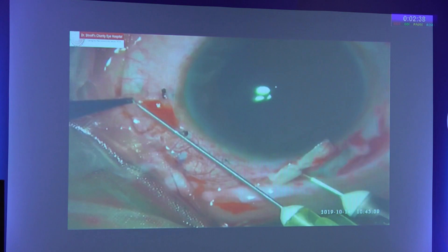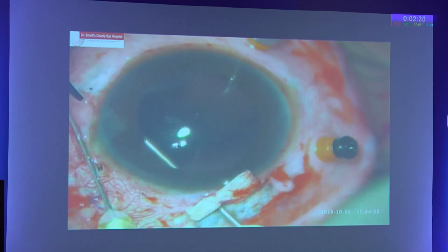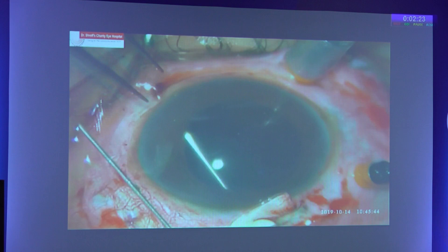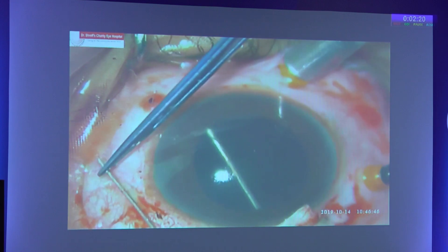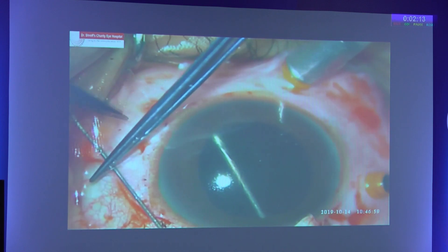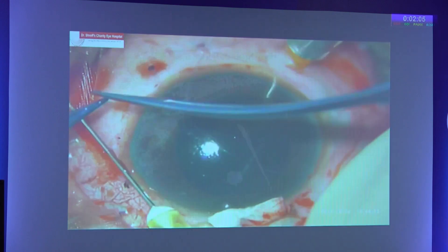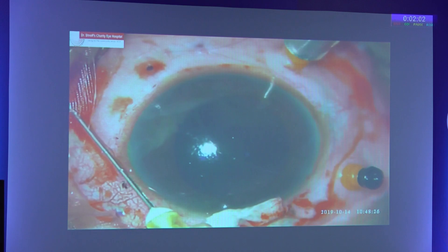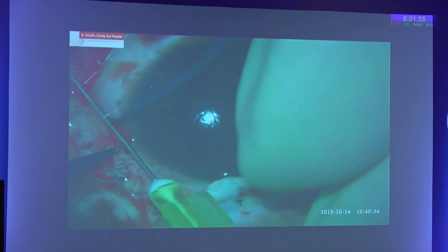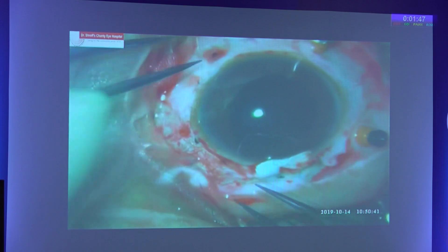This was repeated multiple times and multiple loops were taken out, which were kept in place with the help of the 30-gauge needle. The 30-gauge needle was extended to keep all the loops in place, and the suture was finally pulled out. The 10-0 prolene suture was then passed through all the loops.